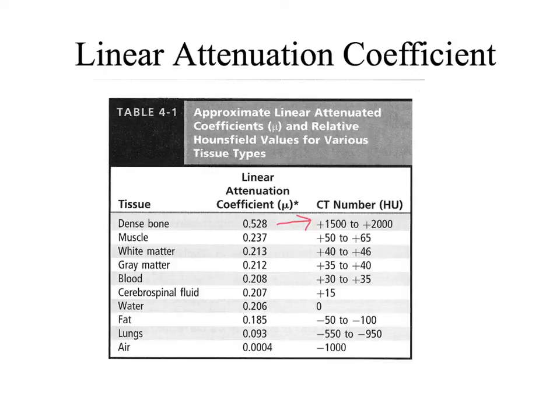All right? So I'm going to show you what I like to call the boring CT party trick, where I'll walk you through what the computer's doing when it's using this information of linear attenuation coefficients from the receptor to then compute an image, right?